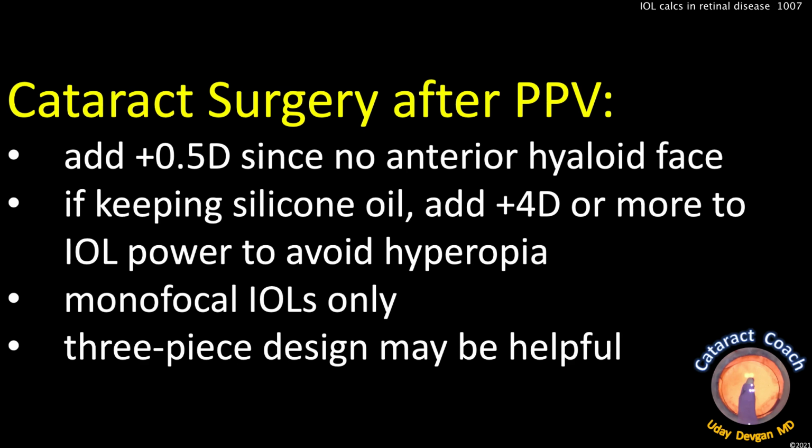If you're keeping silicone oil, add at least 4 diopters, maybe even more, to make sure the IOL is not going to give you post-op hyperopia. Monofocal lenses only and a 3-piece design may be helpful.